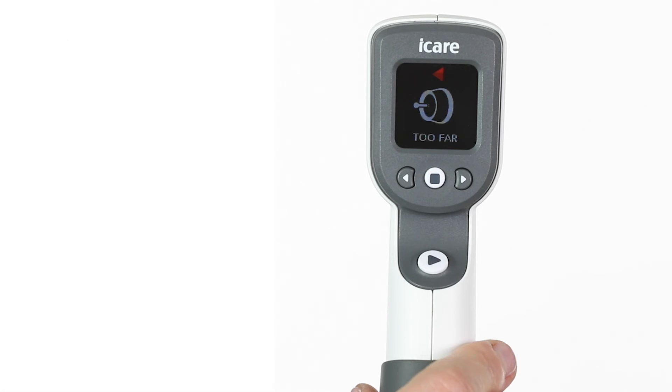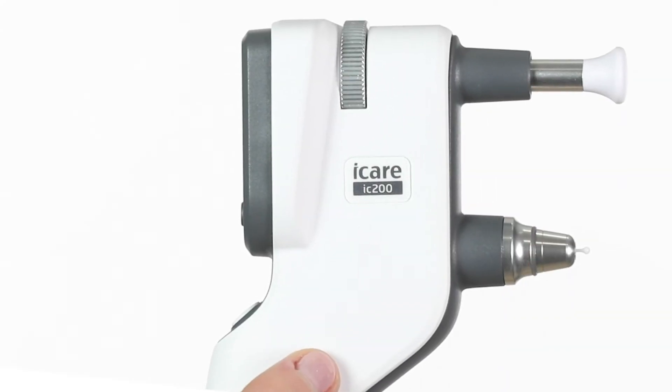For example, if you are too far from the cornea, then too far will show in the display, and the probe base light flashes red.